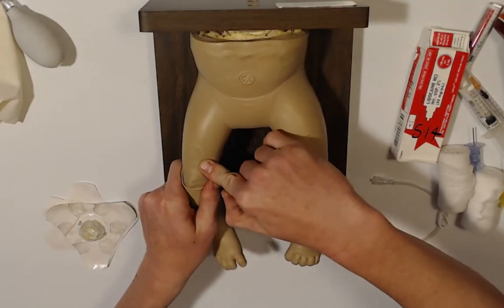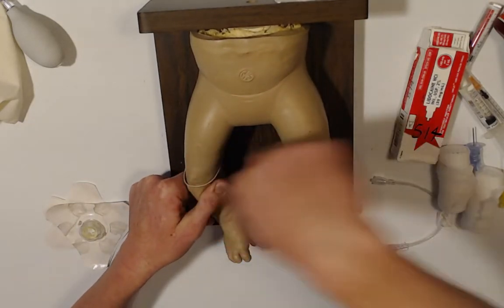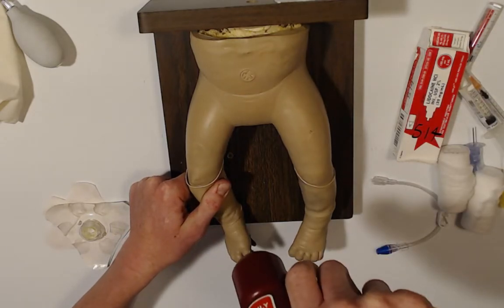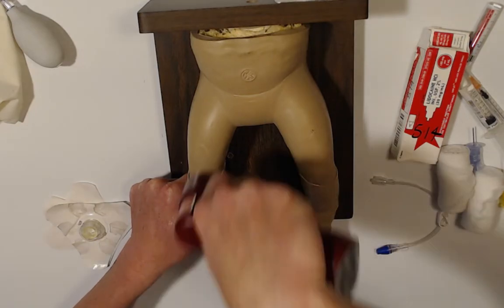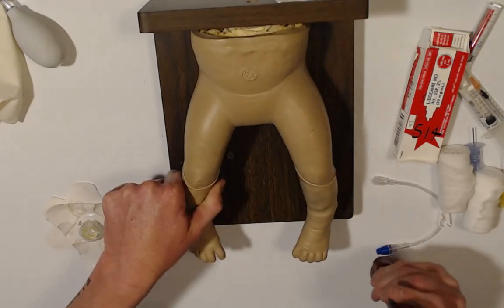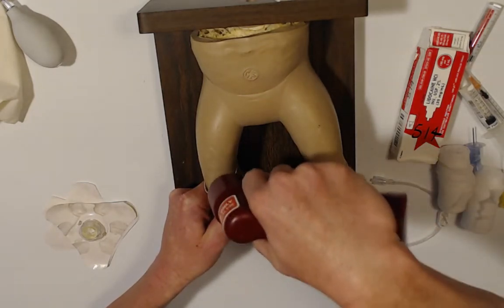You might want to try to bow leg this leg out a little bit, try to flatten it out. And then when we drill, remember we need to go to a 90-degree angle to the bone, not necessarily 90 to the floor. So that way, if you bow leg them out, it helps with your angle.